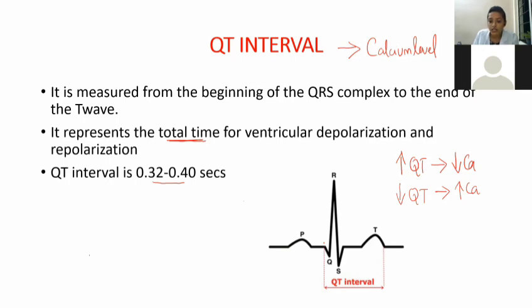And if the QT interval is shortened, it means increased calcium level in blood, or hypercalcemia. So this is about the QT interval.